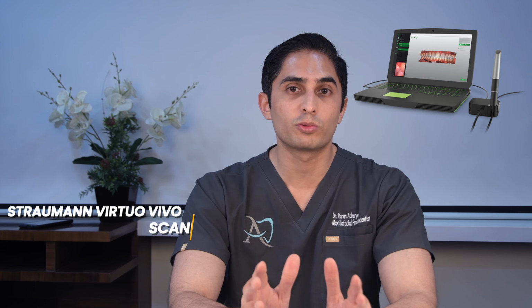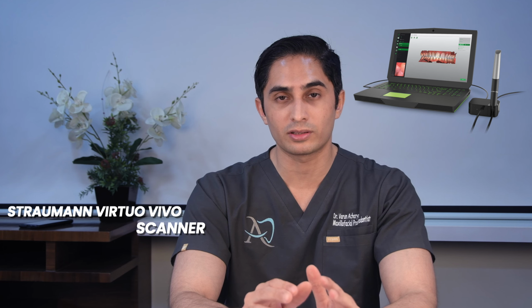Now, the Straumann Virtuo Vivo is a very interesting scanner because out of all the scanners I'm talking about, that is a very sleek scanner. It's almost like holding just a wand, and it's very lightweight and seems very easy to use. But it has, in my opinion, two problems. One, I don't think the resolution or the accuracy of the scanner is that great. I've compared it directly with other scanners, and when we look at it in the lab, it seems like the detail is just a little bit lacking. Again, if your margins are supragingival, it doesn't really matter. We're talking about when we go subgingival, when we have an issue.